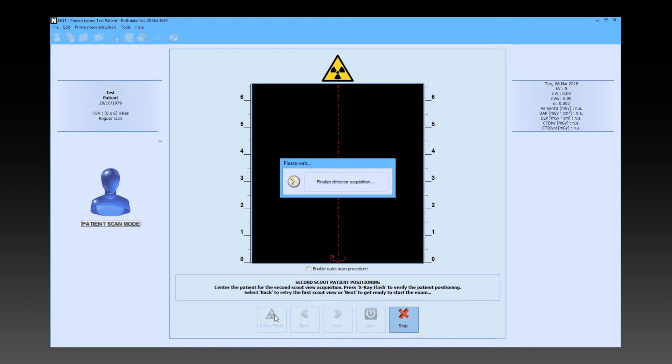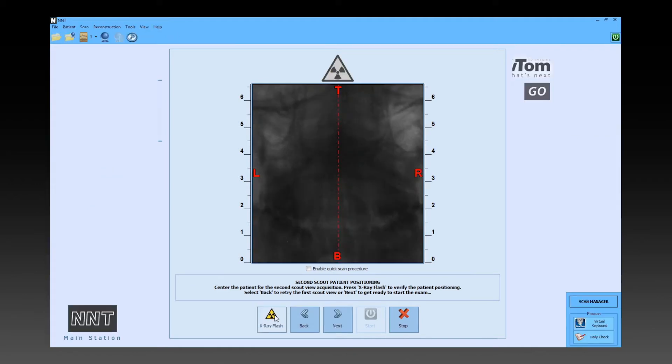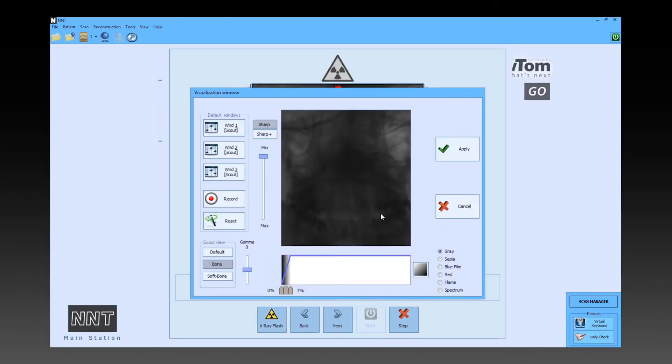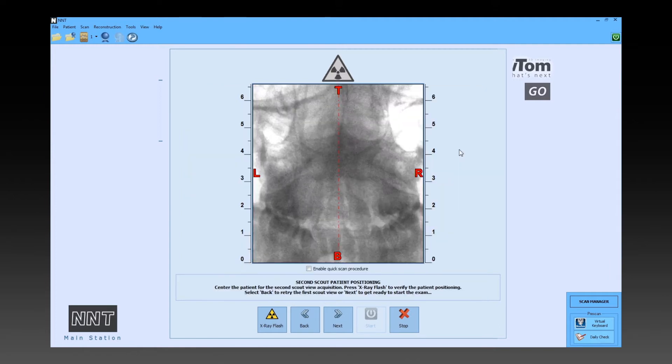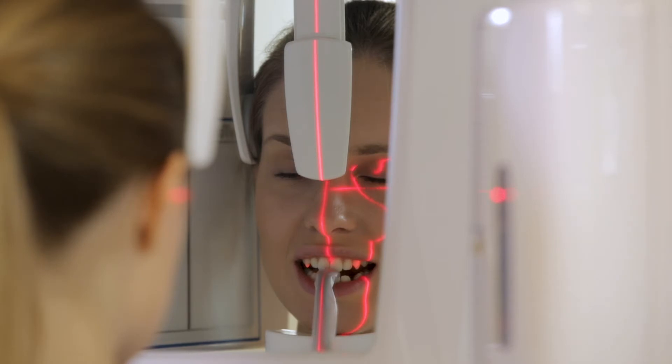The next front scout image is only performed to automatically set exposure parameters. When the parameters are set and the patient is correctly positioned, the dentist presses next and before leaving the room, asks the patient to close her eyes and swallow.